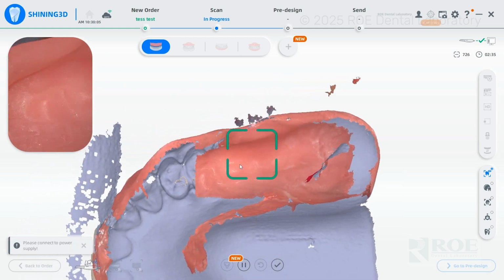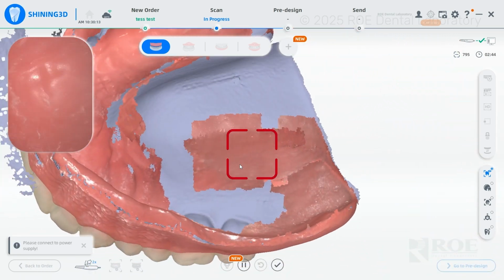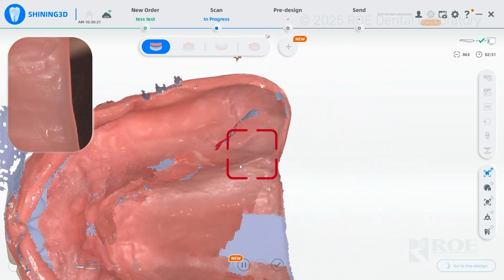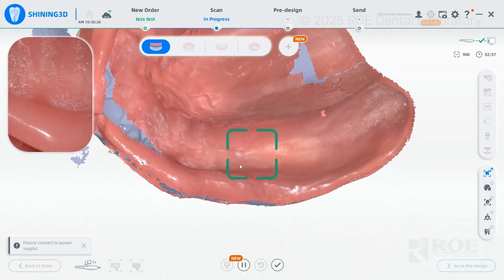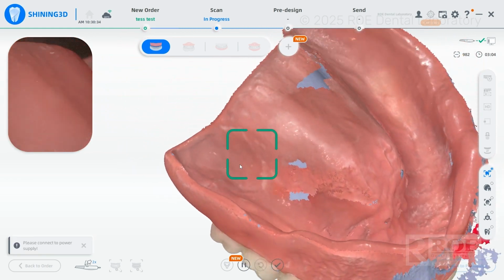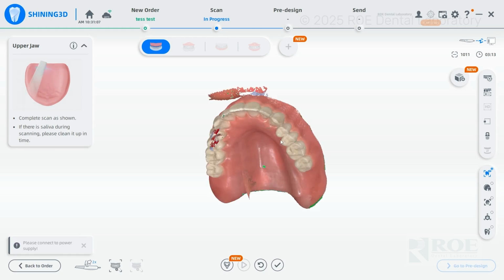Once you've captured your 360 denture scan, we then want an opposing and a bite if we are going to make any changes to the patient's denture. So if you want us to change the wear and tear on the teeth, increase the patient's VDO, we need you to capture an opposing and a bite with your iOS scanner and the old denture in place. Or if you're looking to improve the fit on the denture but keep the wear and tear the same, we just need that 360 scan of the denture.